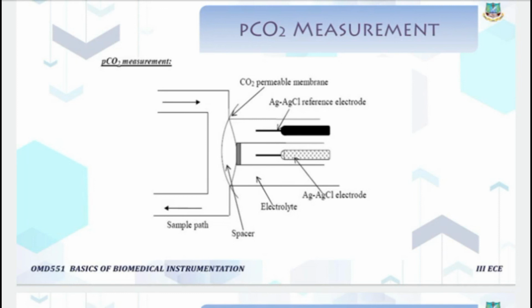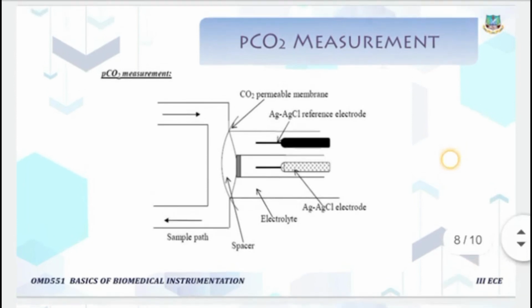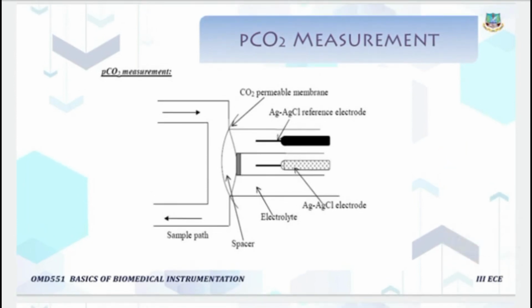So the equation is H2O plus CO2 gives H plus plus HCO3, that is the bicarbonate. Okay, that is the measurement of PCO2.